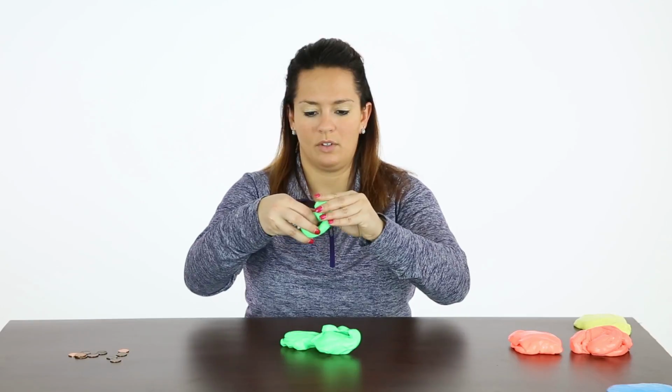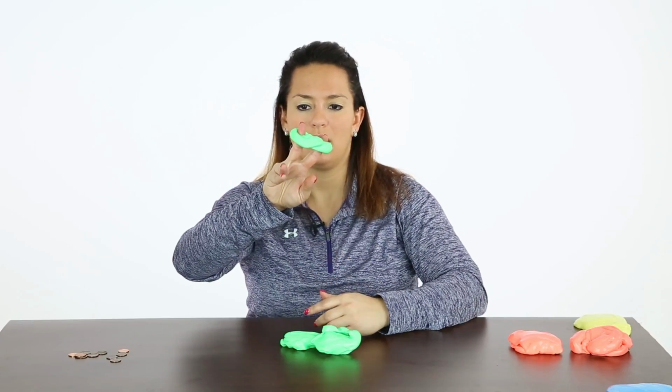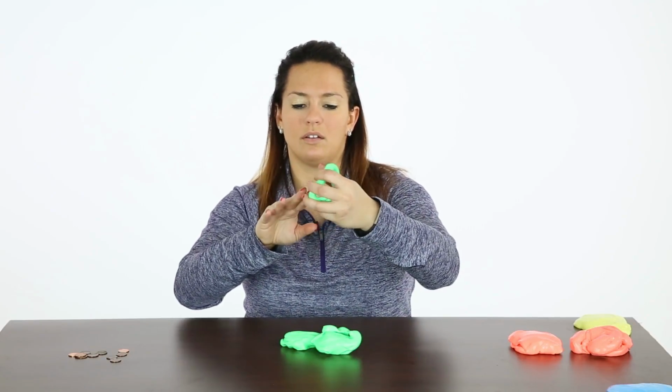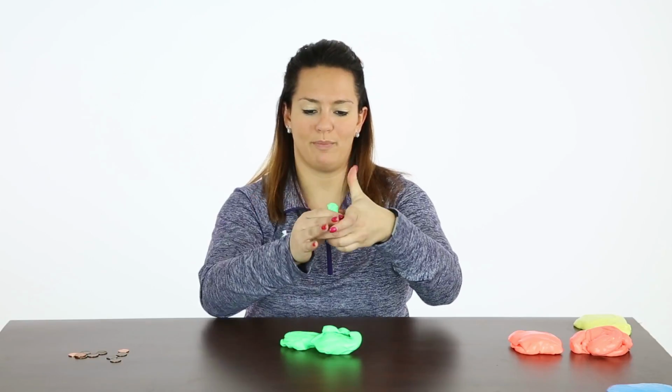And then if you make more of a snake, you can do the opposite by spreading your fingers out. So I'm going to put kind of a circle ring on my 2 fingers and go outward with the putty. So a ball to push in together and more of a snake circle to push them out.